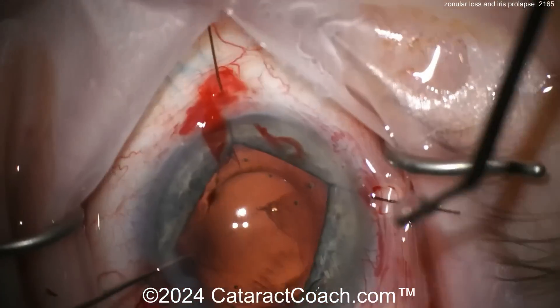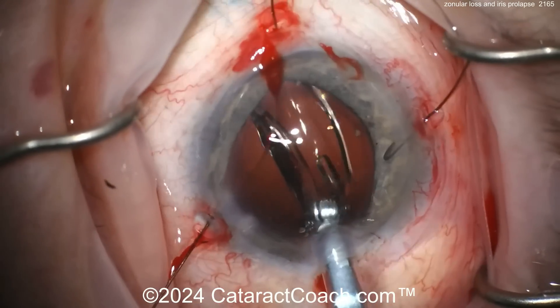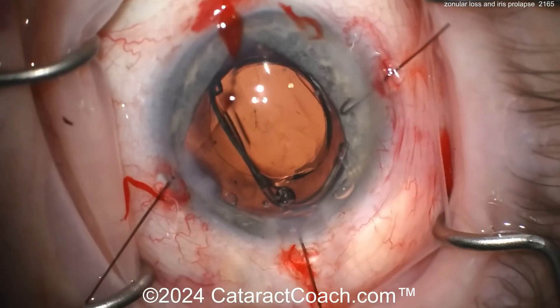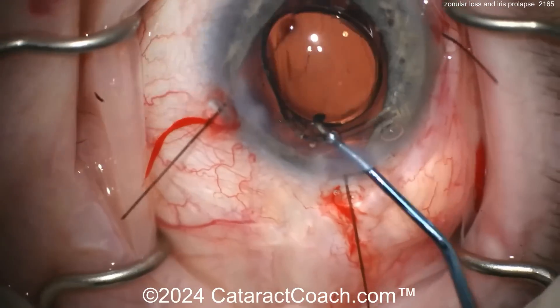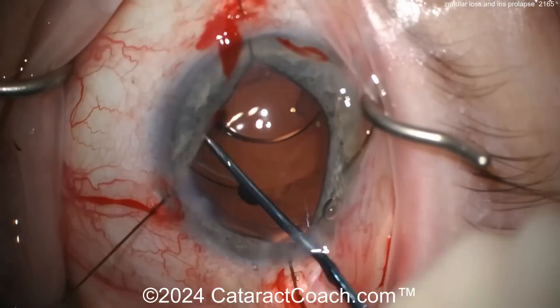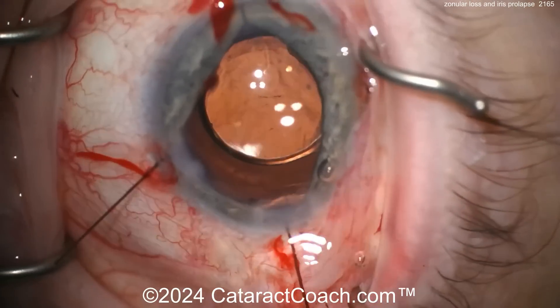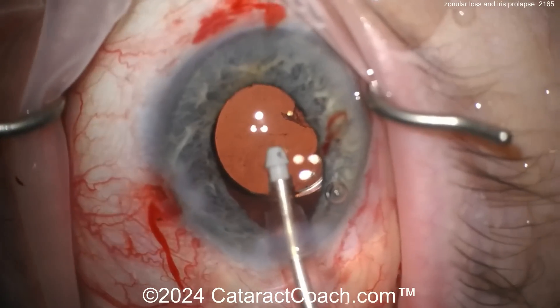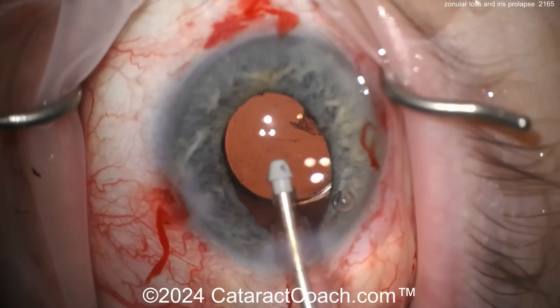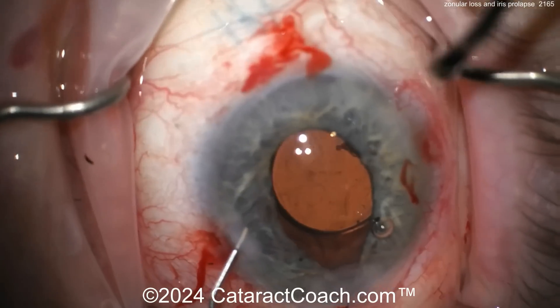Here comes the lens — looks like a single-piece acrylic lens. It looks like a BNL Vista lens, which has a zero spherical aberration profile, which may be better in a case where the lens is going to tend to de-center. I like the lens choice — I think that was a smart move. It has zero spherical aberration as opposed to the slight negative spherical aberration from other competing lenses like Tecnis or Alcon. The iris is still bothering me quite a bit here — this is a tough case.